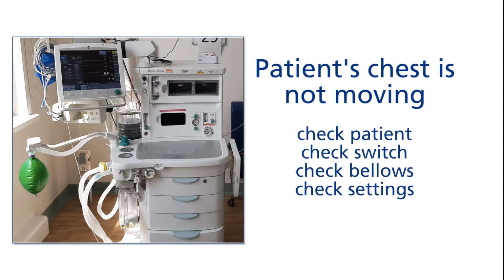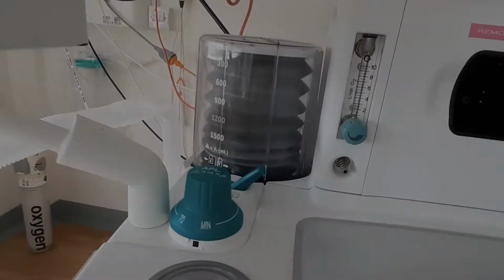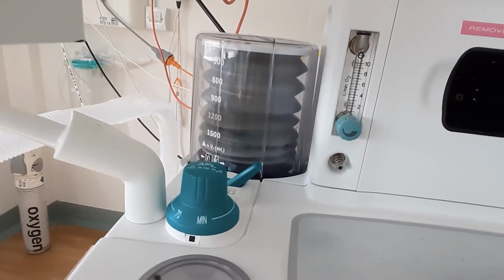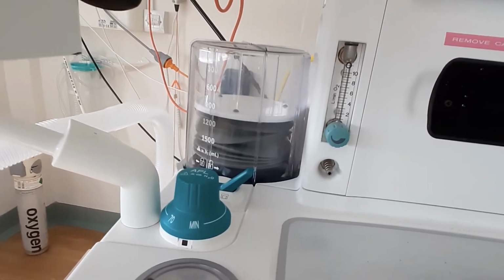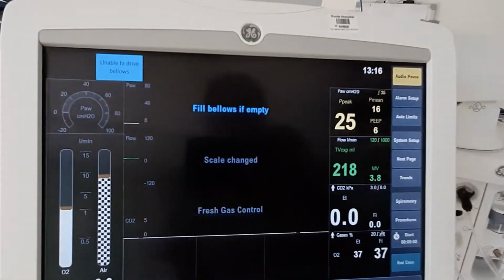If the patient's chest is not moving, you need to check the patient, check the ventilator manual switch, check the bellows and circuits, and check your settings. One reason might be a circuit leak. When this alarm sounds and the bellows are not refilling after every breath, you have to suspect a leak.